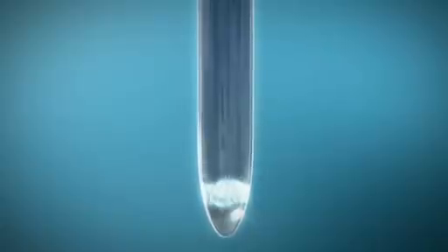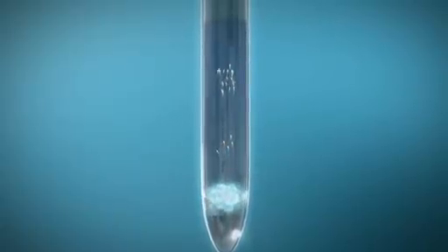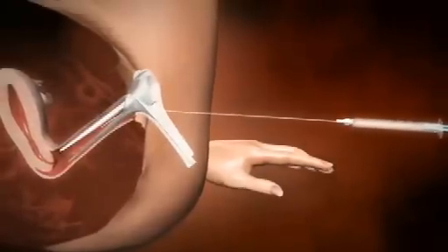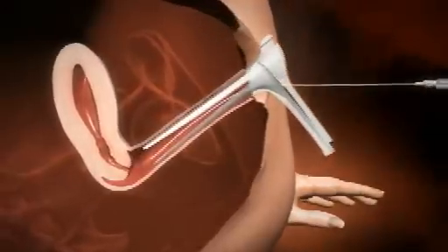With a syringe and fine tube, the prepared sperm cells are then introduced directly into the cavity of the uterus, beyond the mouth of the womb and the cervix. They immediately make their own way towards the uterine tube.